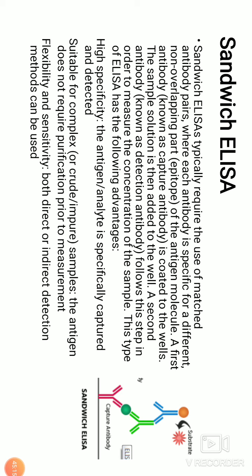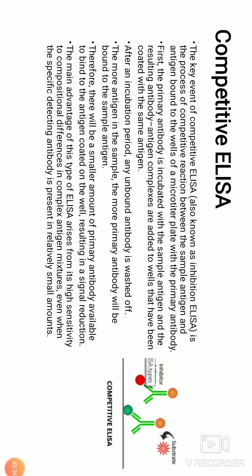Next, it shows high specificity, in that the antigen analyte is specifically captured and detected. It's suitable for complex samples. The antigen does not require purification prior to measurement. There is flexibility and sensitivity, because both direct and indirect detection methods can be used.